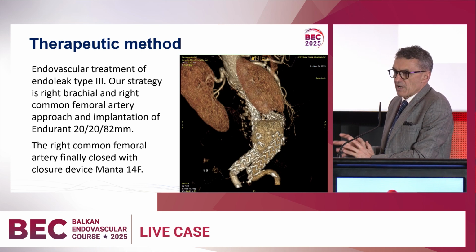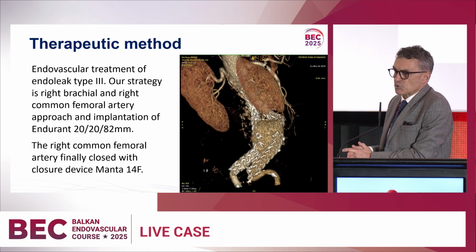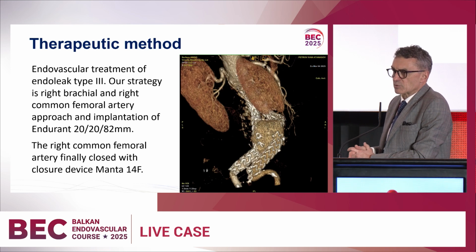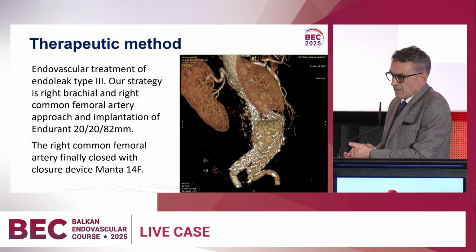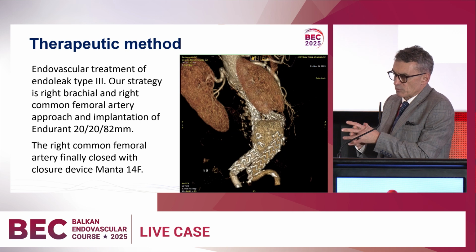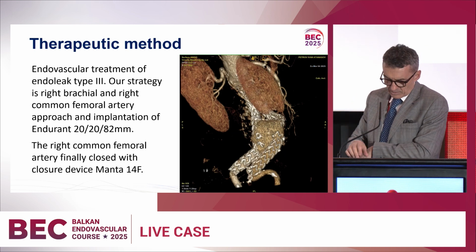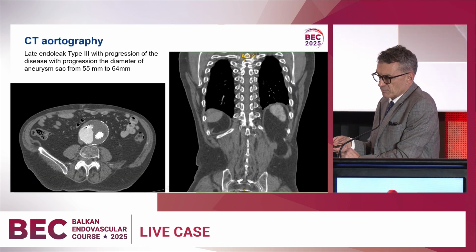This case shows very well that in fact we don't treat the disease. We treat the aneurysm, but the disease will continue. In some cases there is a natural distal growth of the vessels, and this liberates space for migration of the distal graft. Like in this case, the graft migrated distally, and now there is a gap between the migrated endograft and the proximal part of the graft of the endovascularly treated patient.